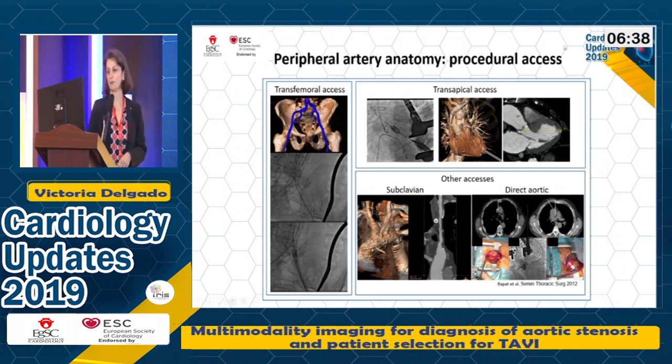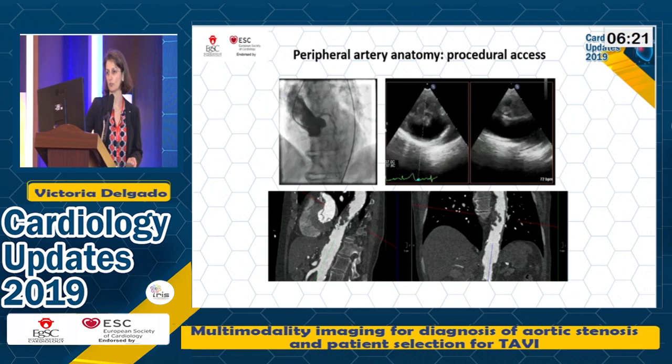So it's very important to have a good assessment of the femoral arteries, and for that we are going to use CT. It's the imaging technique that gives us the best evaluation of the femoral arteries in terms of diameters and in terms as well of circumferential calcifications.